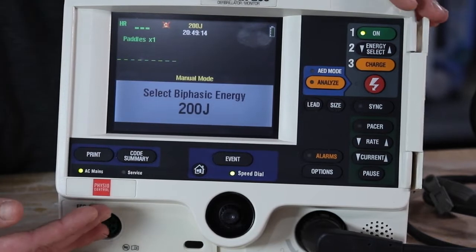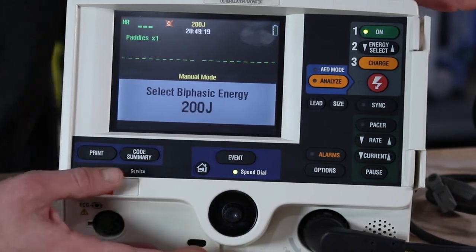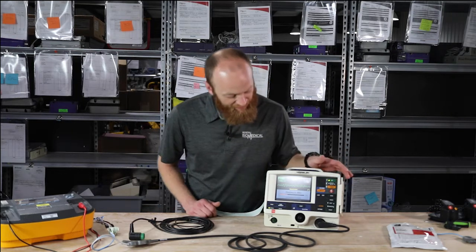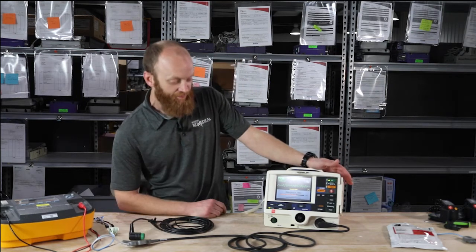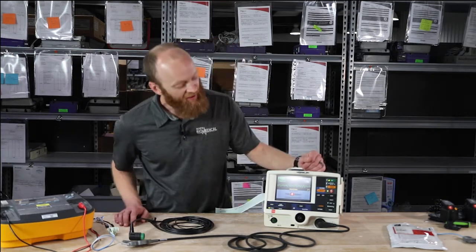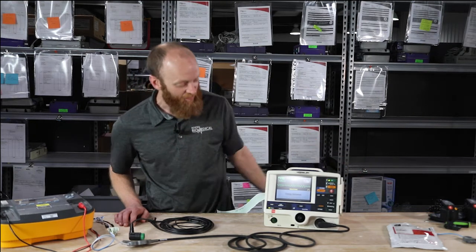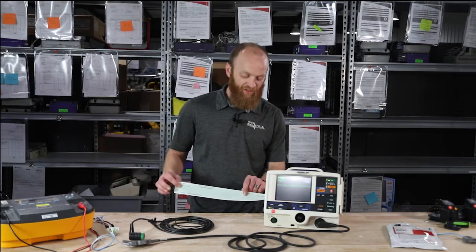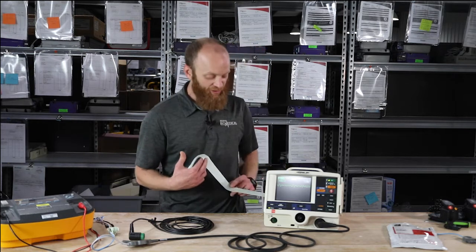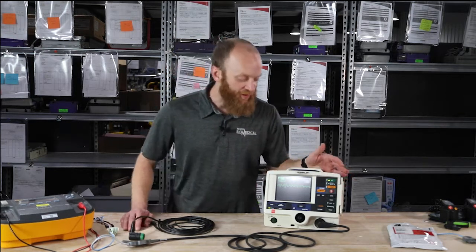The energy buttons are live for energy select down and energy select up. You can still charge at any time, or analyze again if you'd like. We'll go ahead and hit the charge button. 360 joules is max energy on the LifePak 20E. The LED is now blinking for the shock. We push the shock button to deliver the energy, and any time you deliver energy it's going to print — it wants you to have that data, printing a snapshot of the energy and heart rhythm.